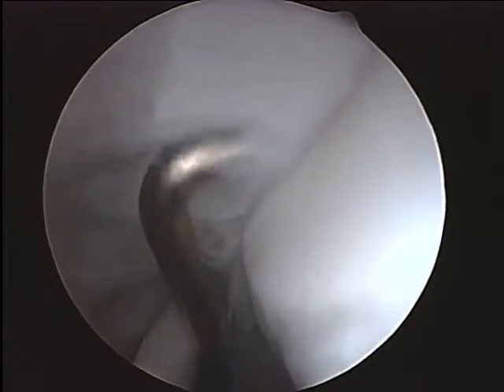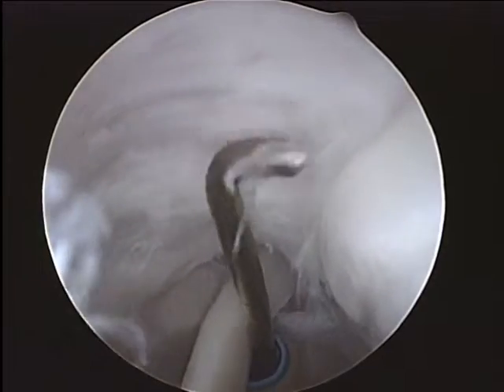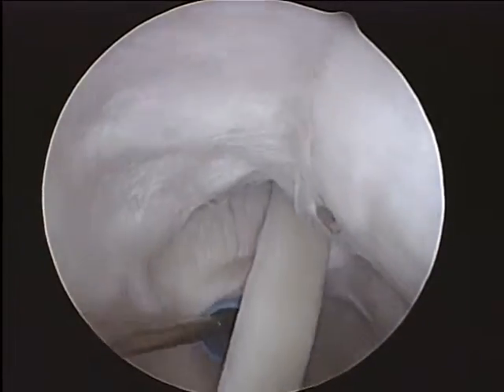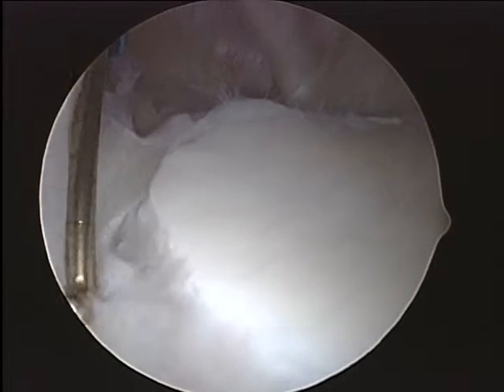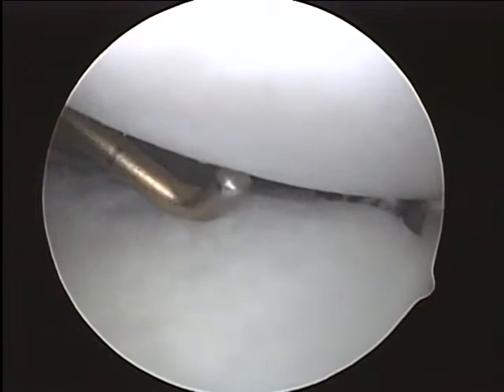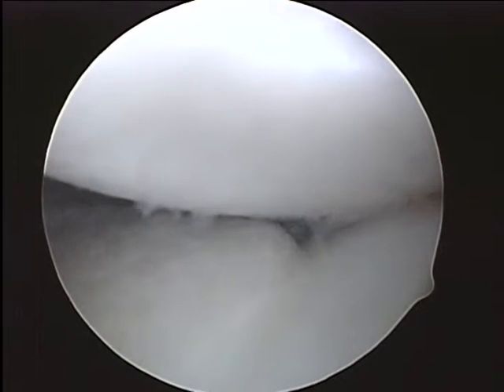This is your rotator cuff tissue with just a little bit of fraying on the undersurface. So all this is pretty magnified. You don't have rotator cuff symptoms or findings on exam, but just a little bit of fraying underneath here. And then here is, up above the socket, supraglenoid fossa, where the top of the labrum attaches, the superior labrum, and posterior and postero-inferior. So basically what I see on this is evidence of prior instability on a joint that on exam really is not even as unstable as its mate on the other side.